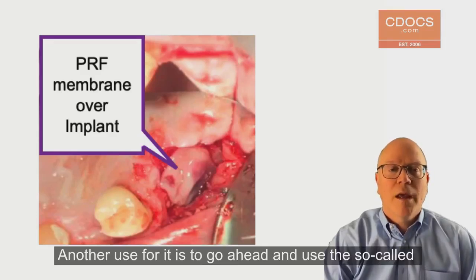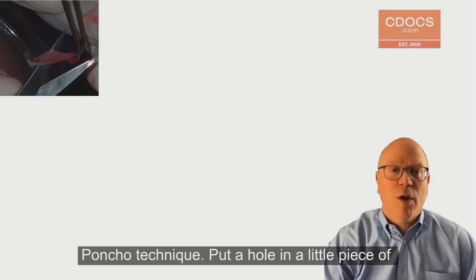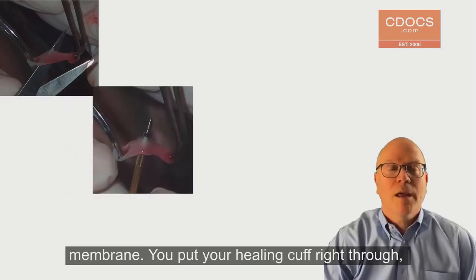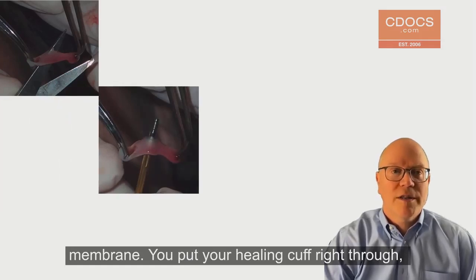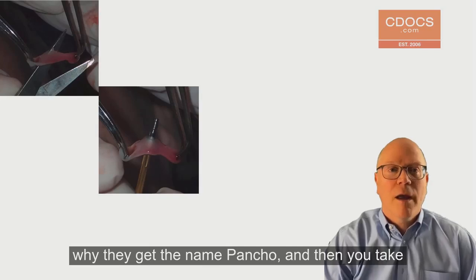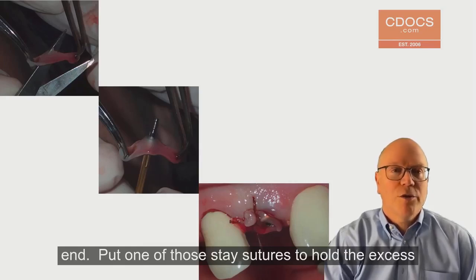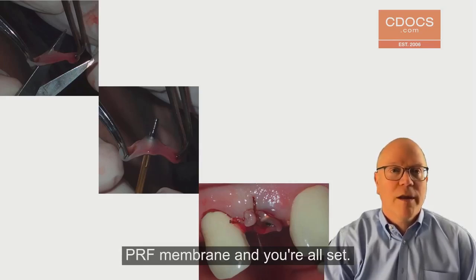Another use for it is the so-called poncho technique. You put a hole in a little piece of membrane, put your healing cuff right through — you can see the threads coming through, which is why they get the name poncho. Then you take that whole thing and screw it into the implant at the end. You put one little stay suture to hold the excess PRF membrane and you're all set.